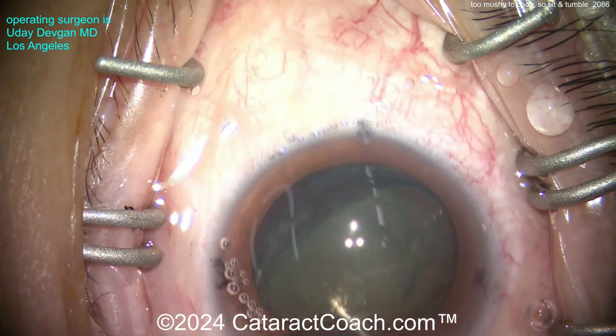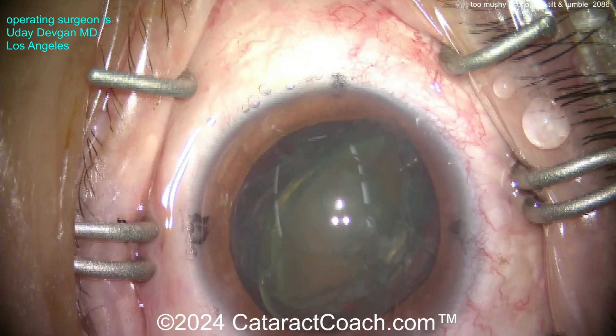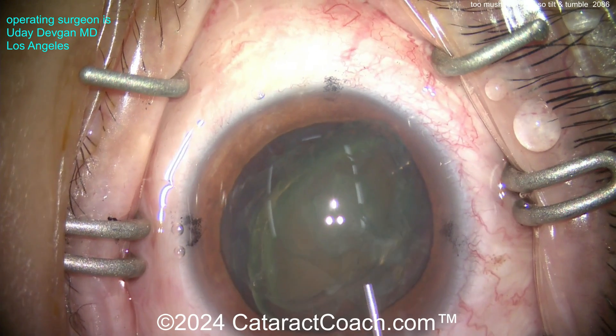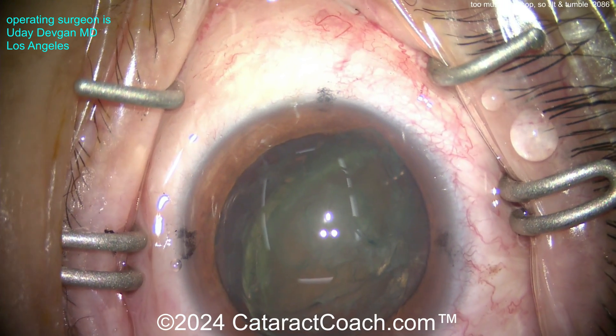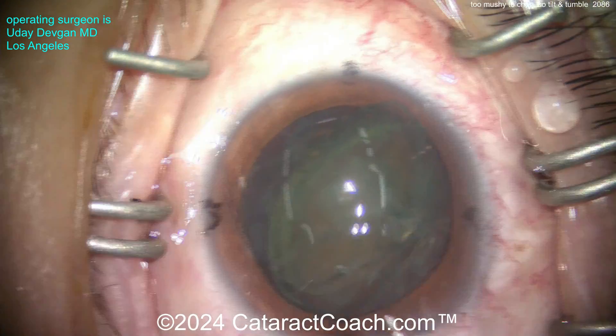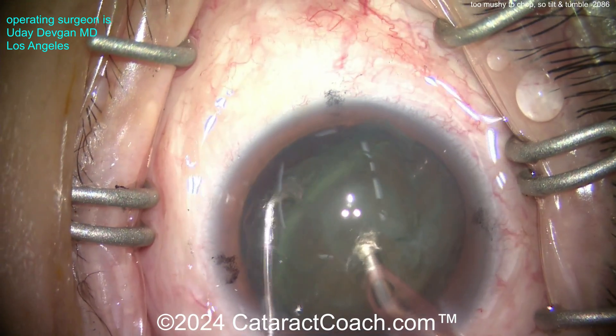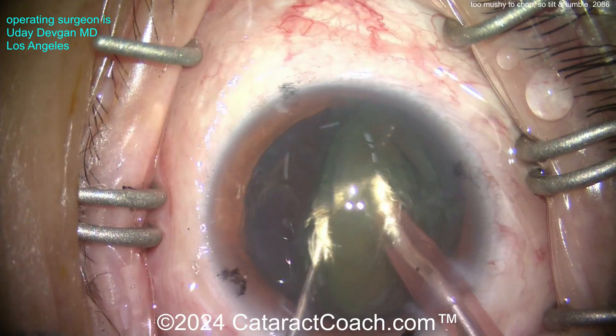So tilt that up. I'm going to try digging it with the chopper and bring it up. Now I'll get the chopper and the phaco probe - we'll try to chop this, but you'll see it's going to be a little too mushy to chop. Here comes the phaco probe, let's get that in the eye. Now the chopper comes in and you'll see - look - a chop doesn't want to work.